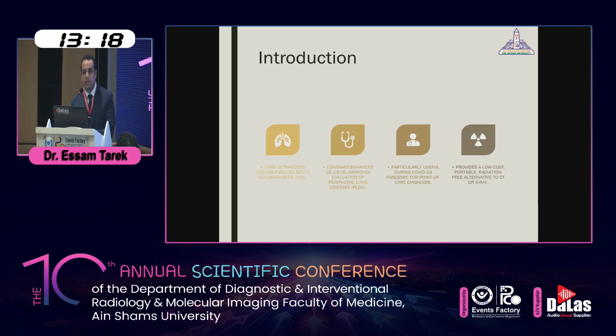If you remember what happened during COVID, most of us, as clinicians or radiologists, rushed to do a CT exam to diagnose the patient or even to triage the patients. This led us to a lot of unindicated CT scans, and we exposed patients to a lot of radiation dose, which was not justified. That's why we tried to figure out if there is another modality that we can rely on. So from that time, ultrasound, either conventional or contrast, started to evolve.